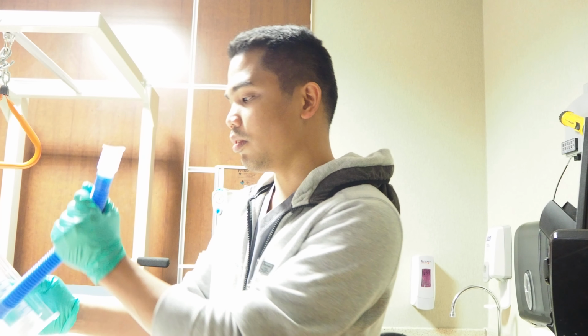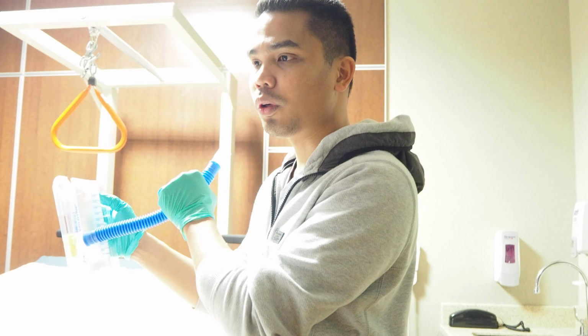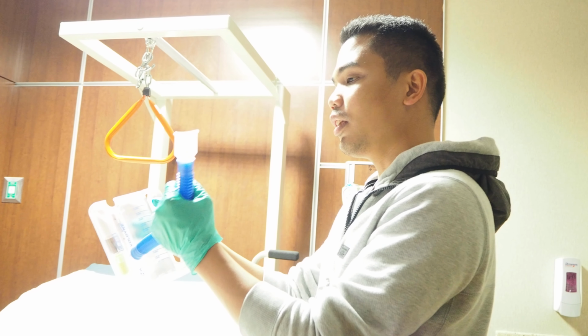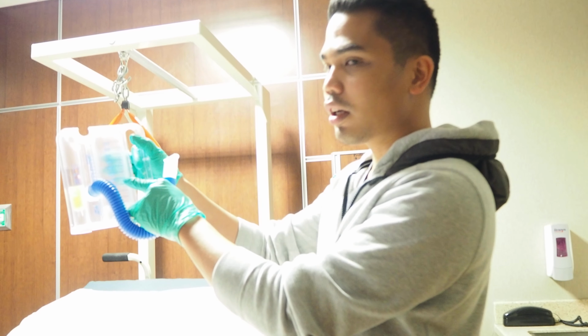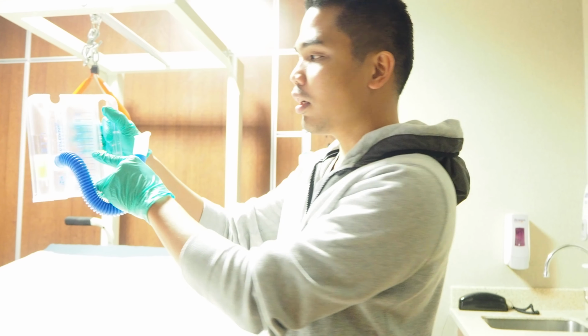First, we should hold it like this. Let the patient exhale away from the device until their lungs are empty. After that, insert the mouthpiece with a tight seal, with the tongue not obstructing the mouthpiece. Then let the patient take a slow deep inspiration until we notice the white piston rise. After that, let the patient hold their breath for about 3 to 5 seconds, until the white piston drops. Remove the mouthpiece and exhale normally.